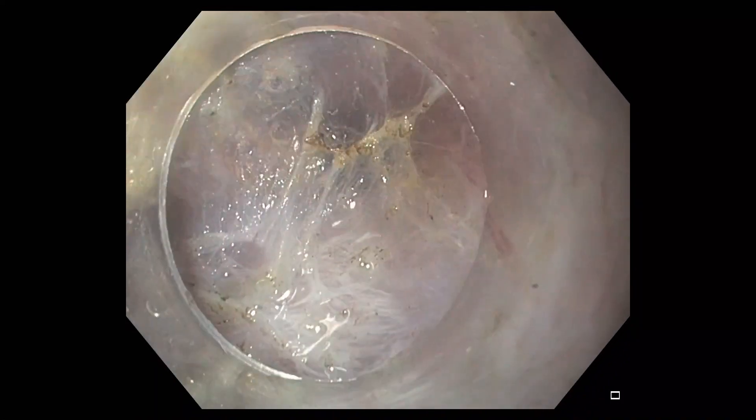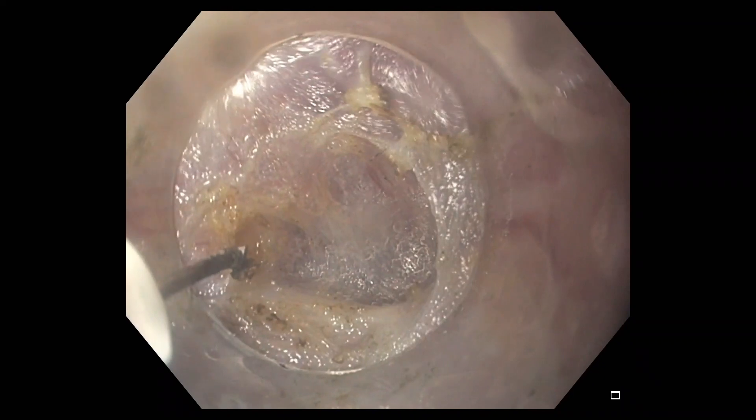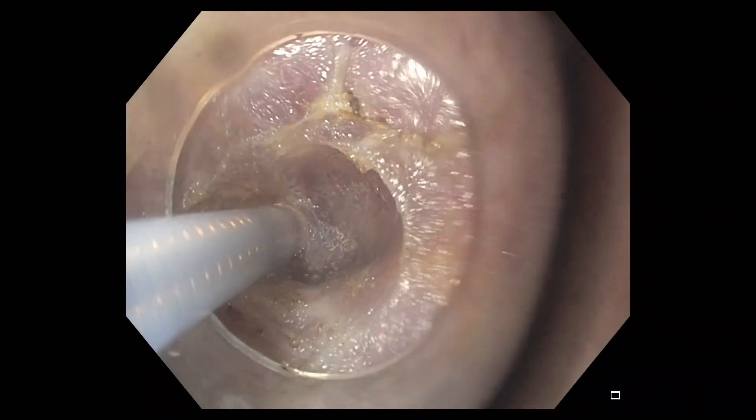Using the integrated water jet function, the submucosa can then be re-expanded. Submucosal tunnel creation is continued until the identification of the pyloric ring. Small bursts of spray coagulation are used to dissect out the pylorus.